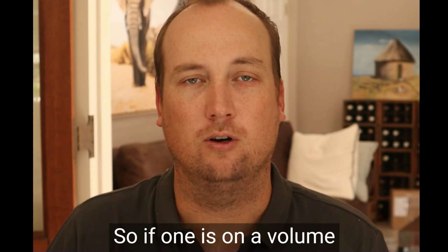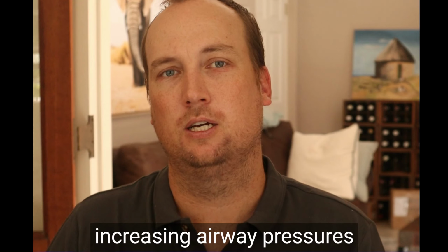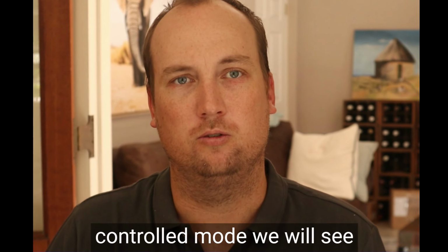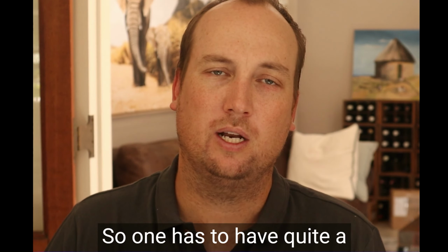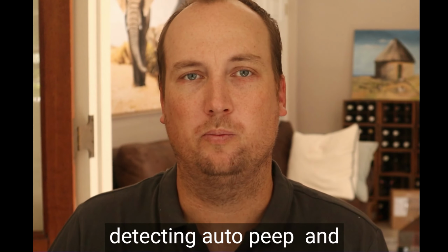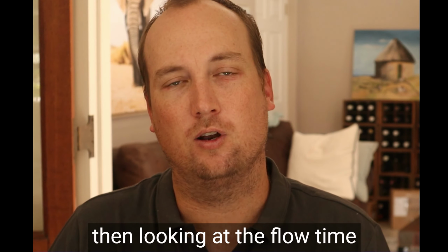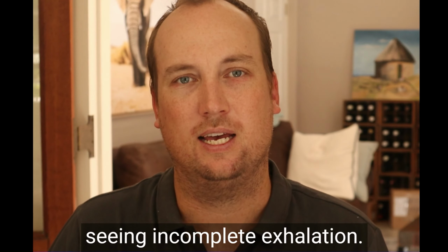So if one is on a volume controlled mode, we will see increasing airway pressures. And if we are on a pressure controlled mode, we will see decreasing tidal volumes for the pressure that we've dialed in. So one has to have quite a high index of suspicion for detecting auto-PEEP. And then looking at the flow time curve is certainly the best for seeing incomplete exhalation.